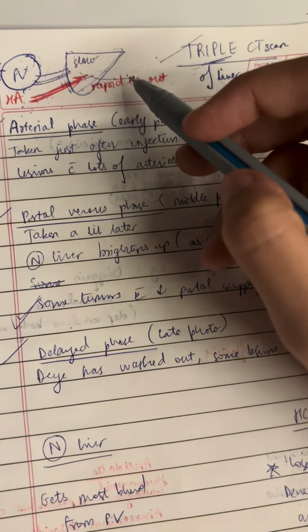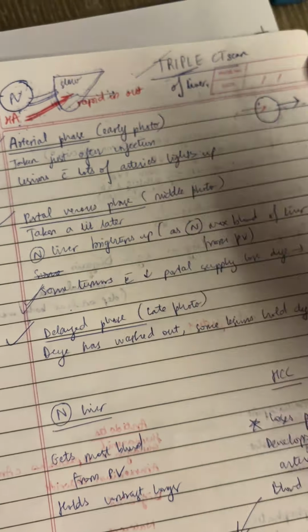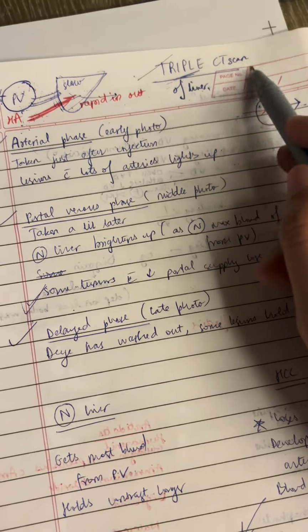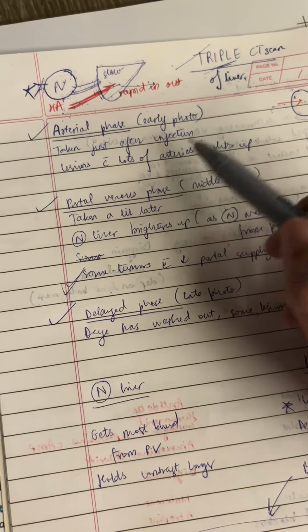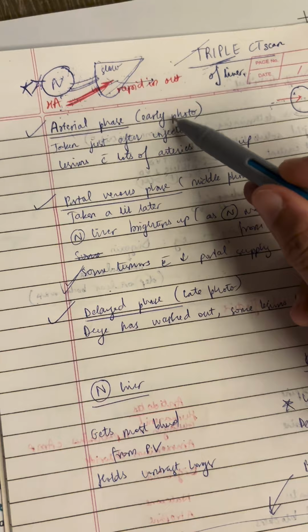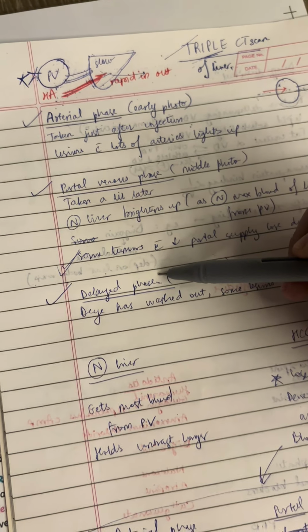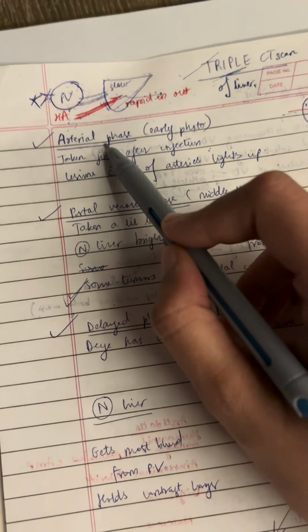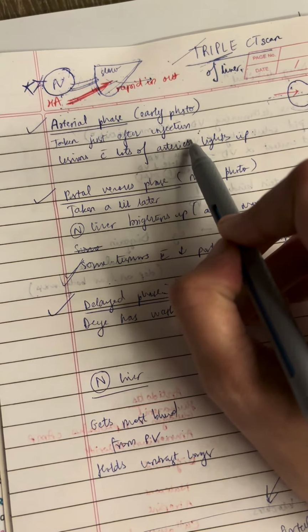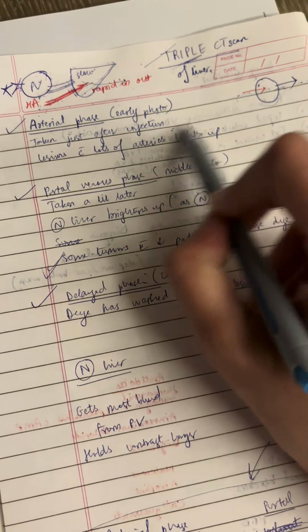Okay. So now after you've understood the basic blood supply of the liver, let's understand what the triple CT scan of the liver does. Basically we inject a dye intravenously and we take 3 photographs of the liver at different times after injecting the dye. The first photograph, which is the earliest, is the arterial phase. It is taken just after injection. So lesions with lots of arteries will light up here.